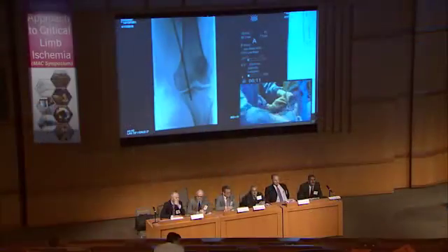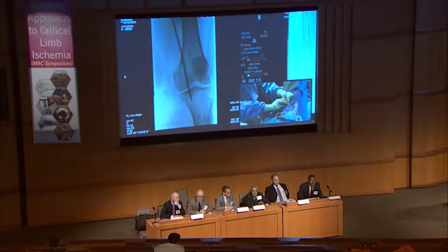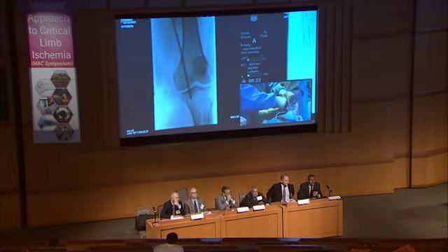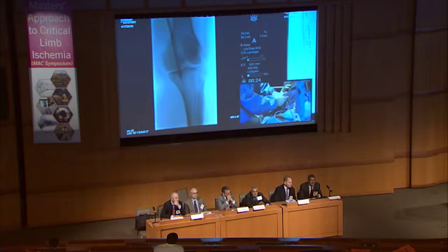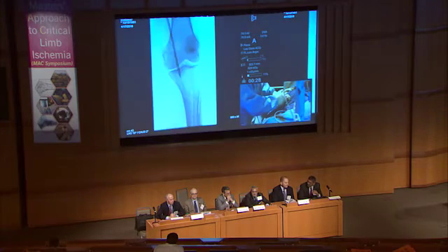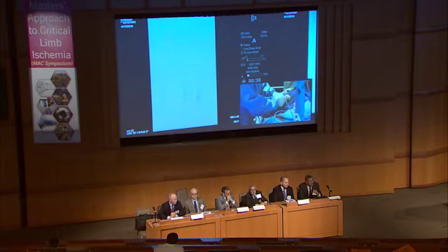This might be a minor point, but that SFA balloon wasn't fully occlusive, so you were still getting some flow down there, which may be showing some flow into the venous system. So we don't really know whether there was actually anything down the SFA, primarily because there's still flow in the profunda. Yeah, I agree. It wasn't completely occlusive. I agree. Excellent suggestions from the audience.